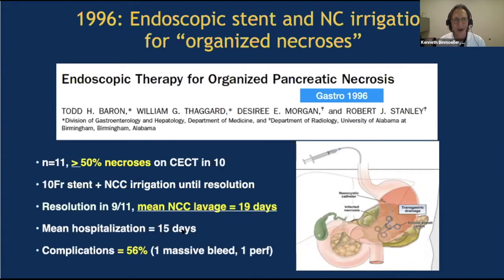I'm not quite sure why the hospitalization was shorter than the nasocystic catheter lavage, because you'd think that these patients are all inpatient when undergoing the lavage, but maybe some were discharged earlier. Complications occurred in 56%. So this was not a benign procedure by any means. 1 massive bleed, 1 perforation.